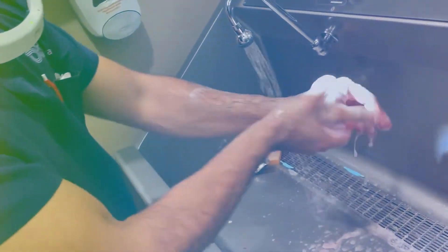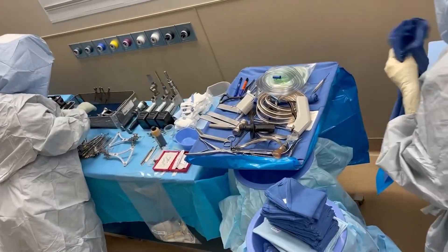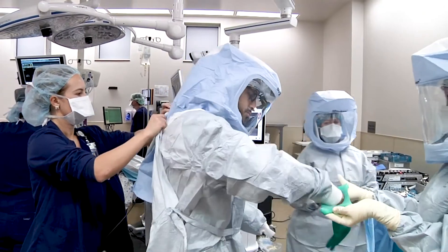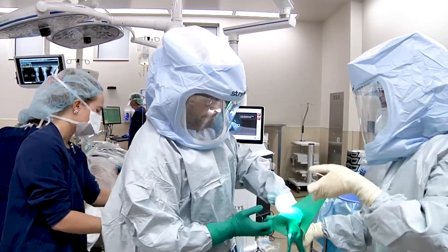We will begin with a three-minute two-step sterile preparation to ensure sterile technique. Here's a view of the sterilely prepared back table and here are standard x-rays obtained prior to the surgery. Now we are gowning and gloving in sterile technique, which helps maintain our ultra low infection rate here at OrthoNebraska.